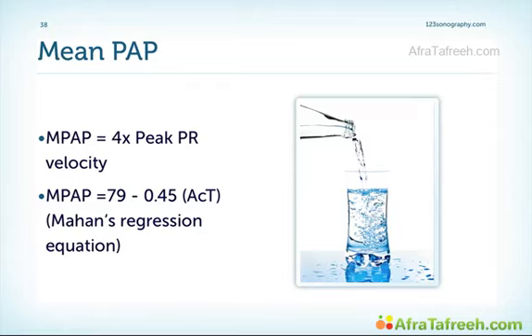Okay, Andreas, you've got a bunch of nice formulas here for us, but now, in reality, how often do you use them in your clinical practice? Well, Tommy, to be honest, hardly ever. So the key message is, yes, you can do it, it does work, but you do not really need it.